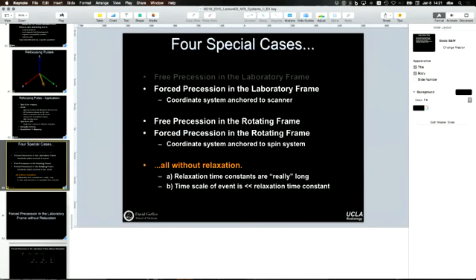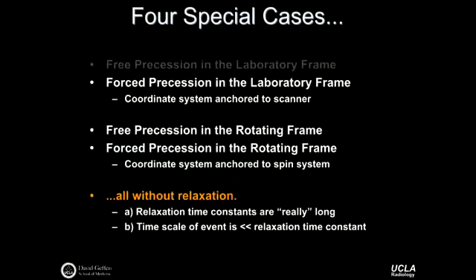So I want to talk about these special cases again. So at the end of the last lecture, we had worked our way through free precession in the laboratory frame and got this result that just showed us that the transverse components of magnetization precess.